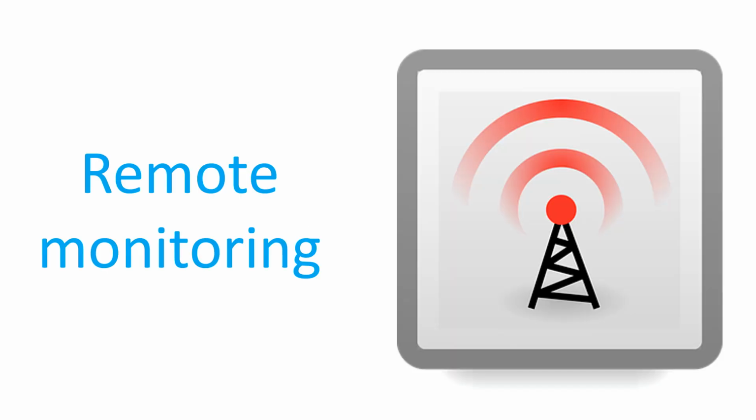With modern ICDs, remote follow-up is also possible with basic data from the ICD being transmitted over a wireless network to a physician located even in another continent. But changing programmed parameters will need a visit to the nearest specialist center. Wireless access to medical devices has always raised concern about unauthorized malicious access.